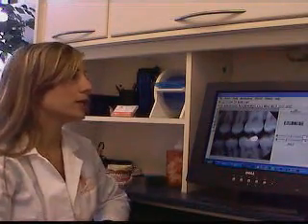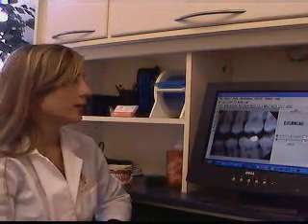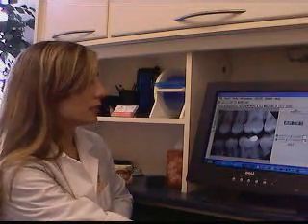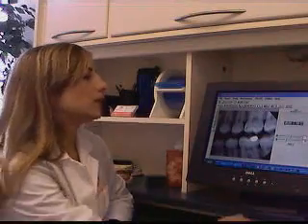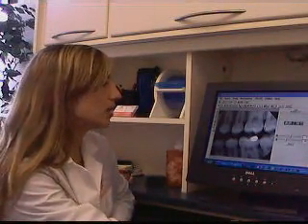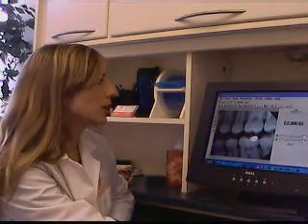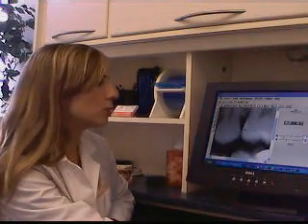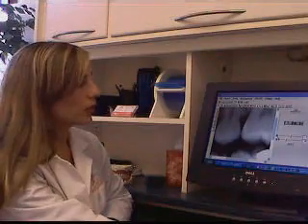Digital x-ray is something really amazing. It's really fun to work with digital images because you can play with them. You can zoom in on an image — so let's say between teeth is an area that tends to have a lot of cavities. If I want to take a close look at this area on this x-ray here, I just press my little zooming tool and I can zoom right in on one certain area and look at it closely.